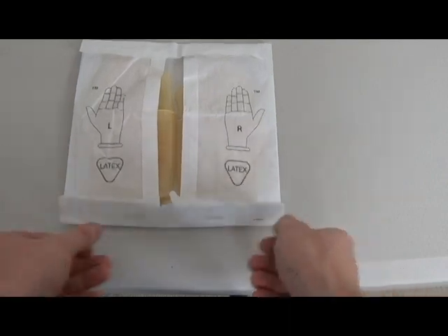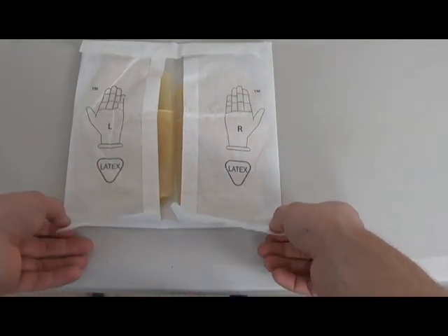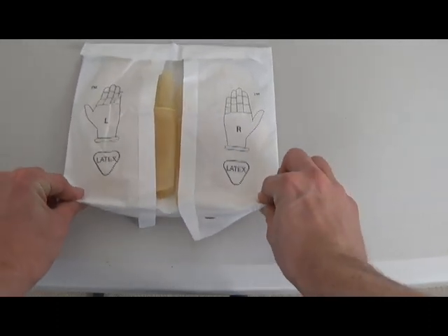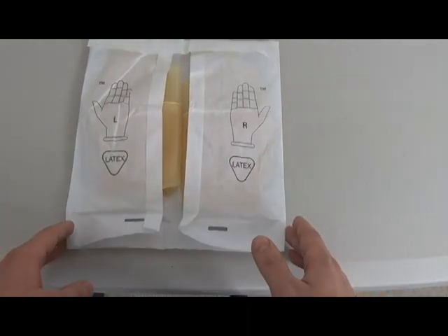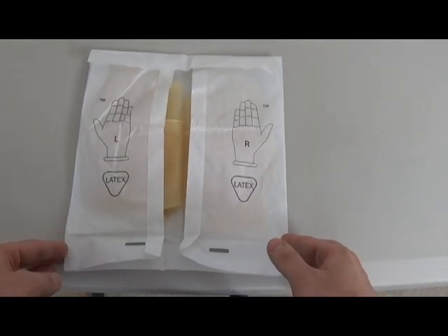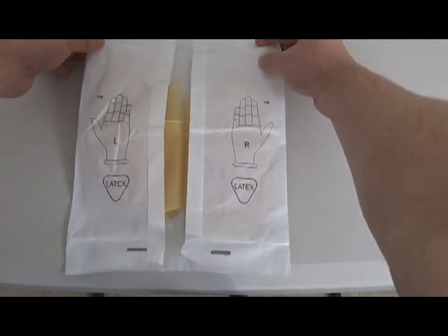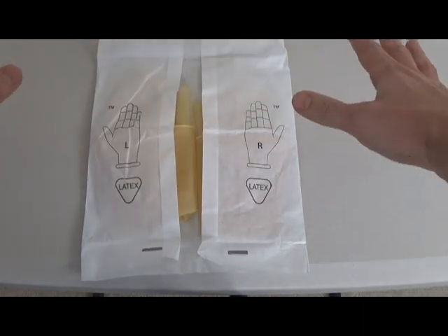And notice I'm not going to grab from here. Again, I want to stay away from that middle, so it's going to be more on the edges right here. And as you see, I'm going to almost fold it on itself so it stays in place. I feel like that's important, and sometimes it is missed. Same thing at the top, just like I did at the bottom: fold it on itself, give it a little pinch so it stays in place.